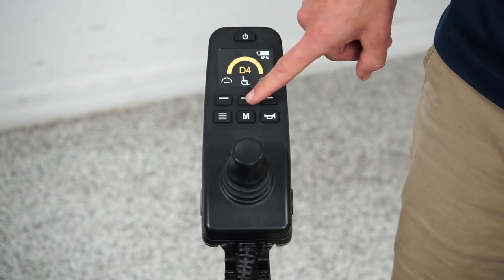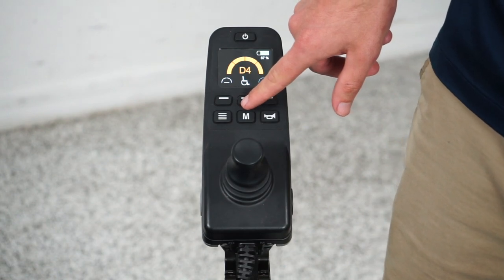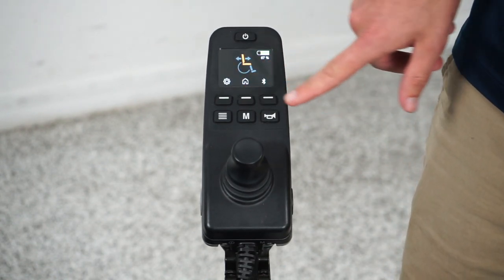The center button has a little picture of a wheelchair on it. This will take you to the function menu, which I'm going to cover in just a second.